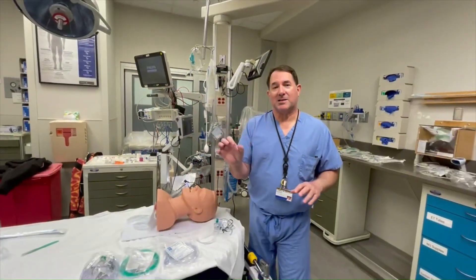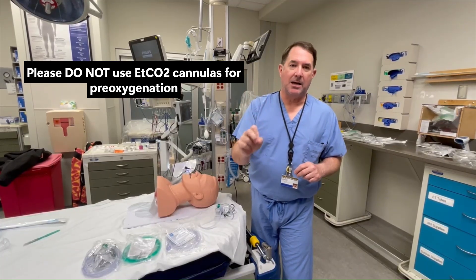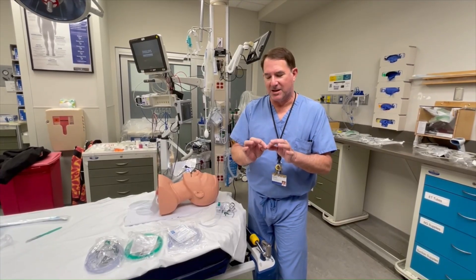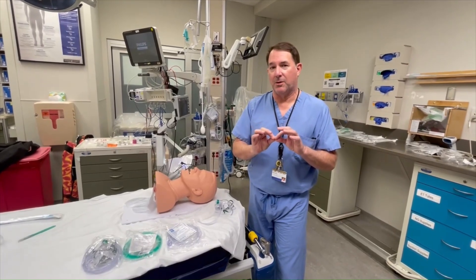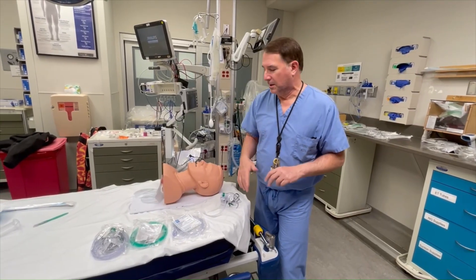The end-tidal CO2 cannula that's got the tab on it that measures end-tidal CO2 is not amenable for pre-oxygenation. It should not be used. The orifice of that is extremely small and you can't get a high flow rate through it. Please do not use that cannula to pre-oxygenate a patient.